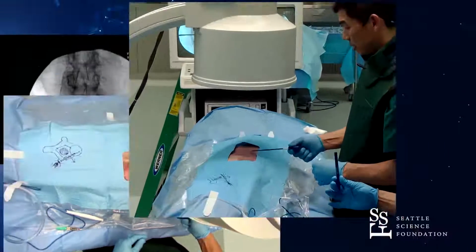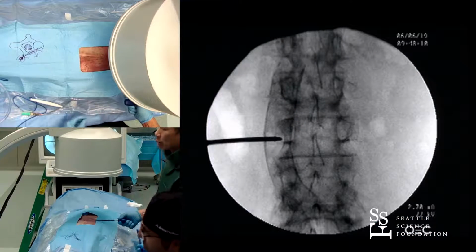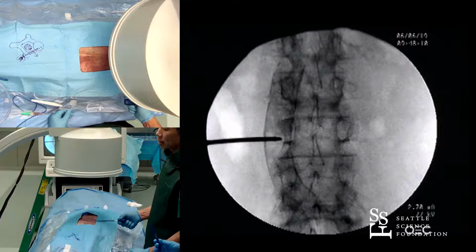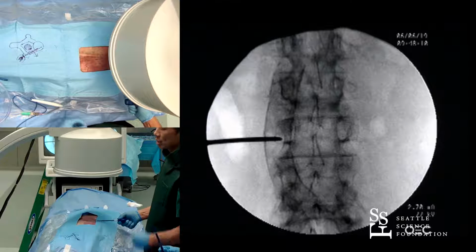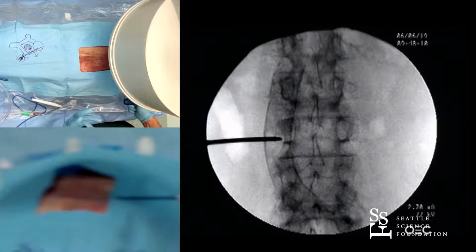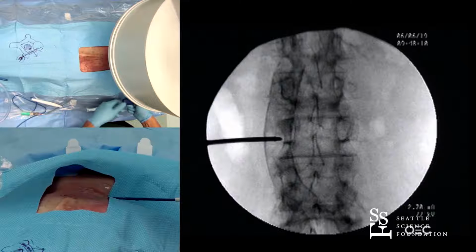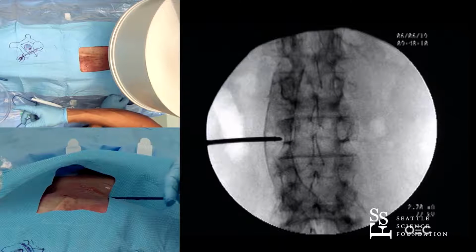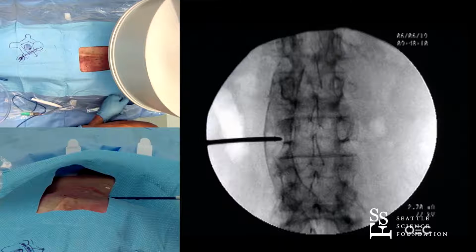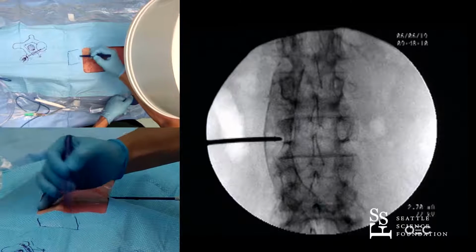Okay, good. Shot. Do you see, right lateral of my pin here, that circular target on the fluoroscope, on the x-ray image? That is the pedicle. That's exactly what we want to cannulate. So when we look at it, our view is a little bit of a square.